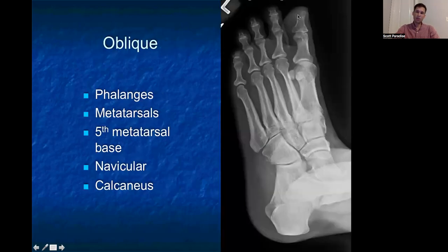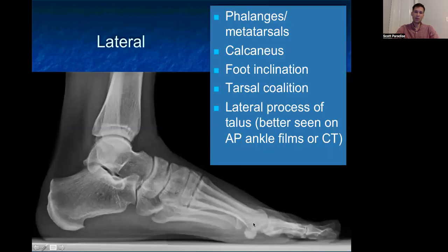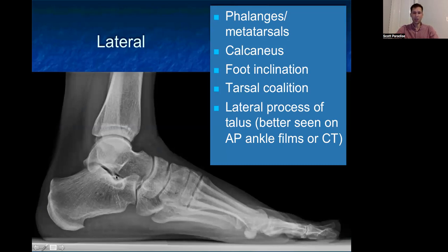Next on the oblique view, fairly similar: look at the phalanges, then the metatarsals, and get a little bit better view of the tarsal bones here. I also want to make note of any extra ossicles I see throughout my views — here I see os peroneum — and then I get an okay view of the calcaneus. On the lateral view, again moving distally to proximally, starting with the phalanges, moving up to the metatarsals, looking at any tarsal bones as well as the calcaneus, where I get a really good view of the Achilles insertion and plantar fascia insertions. I also get a sense of foot inclination — pes planus or pes cavus — and I can see the lateral talar process here, although that's better seen on AP ankle films or CT.